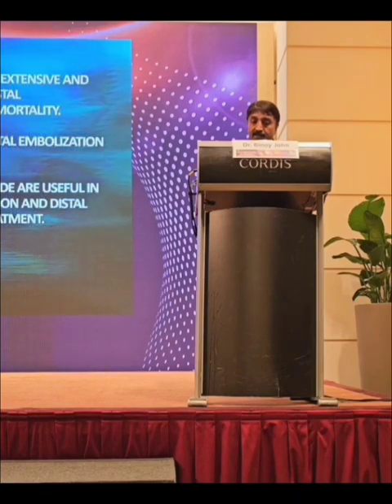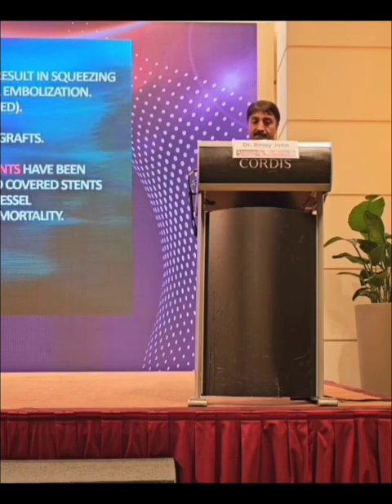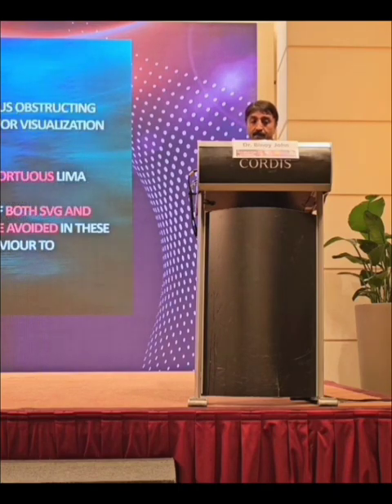Vein grafts more than 3 years old are more degenerated and have a higher potential for distal embolization. EPDs will help to prevent distal embolization, and vasodilators can be used in the treatment and prevention. Stents are best sized 1:1, and oversizing should not be done as it can produce extrusion of atheromatous material. Oversizing of the stents can also result in perforation. Restenosis rates are much reduced with DES, and they are superior to covered stents and BMS.